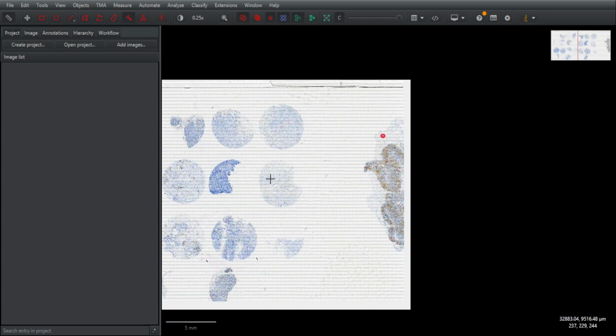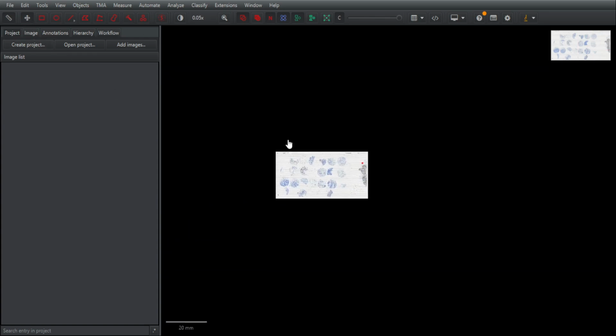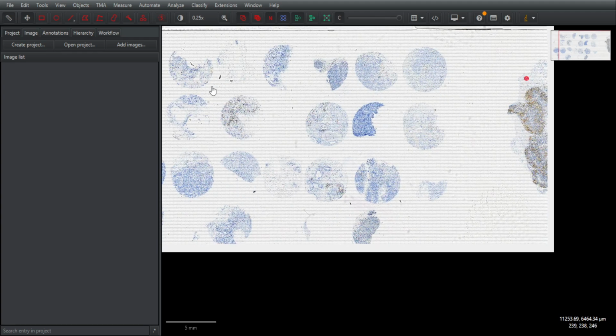So this is a small part which I have given. And after detecting each circle, you can go to the TMA. You can see all the annotation measures, copy them into an Excel sheet, and you can start analyzing them. So that's one thing you can do.